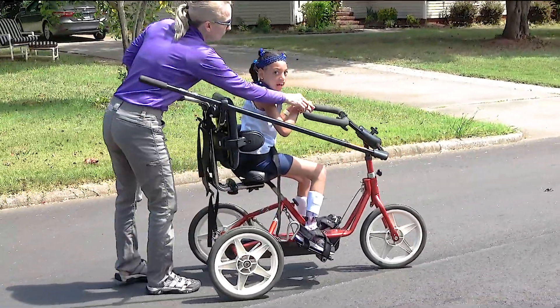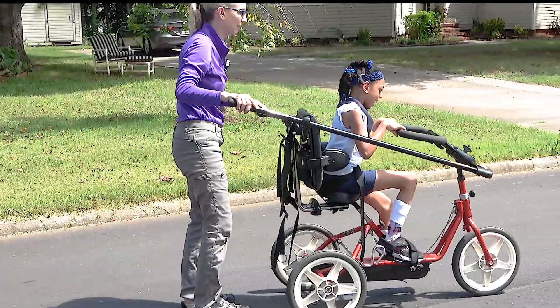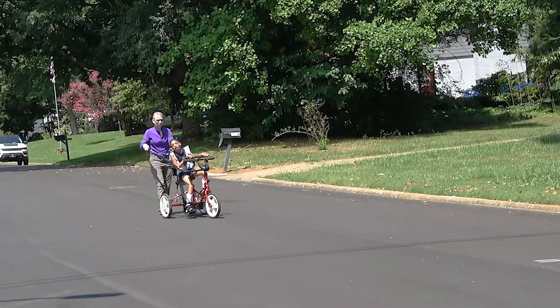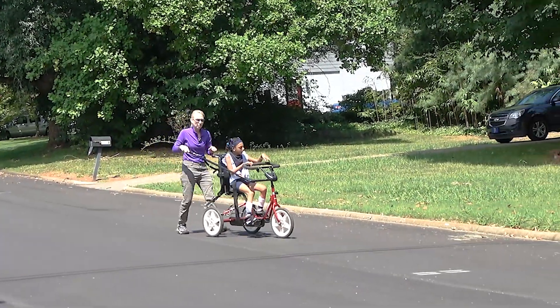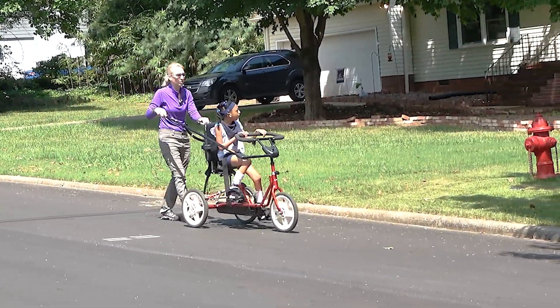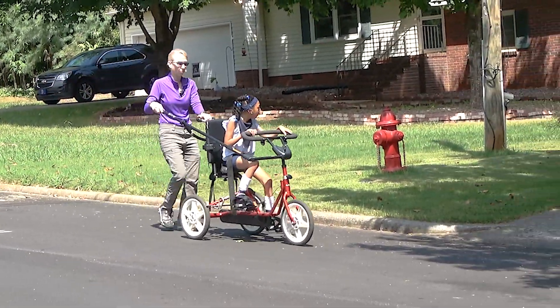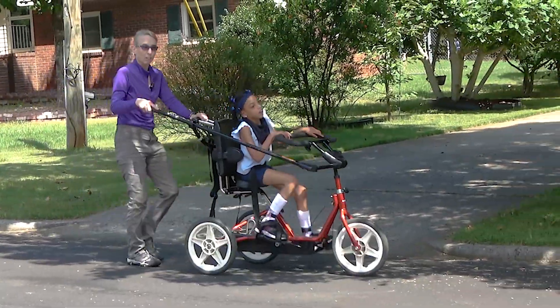Alexis, both hands need to be holding on. This tricycle does come with a chest harness that you can use. Alexis does a better job holding on if she's closer to the steering bar, so we don't use the chest harness for her. She's got reasonable trunk control. With just the seat belt, she's safe.